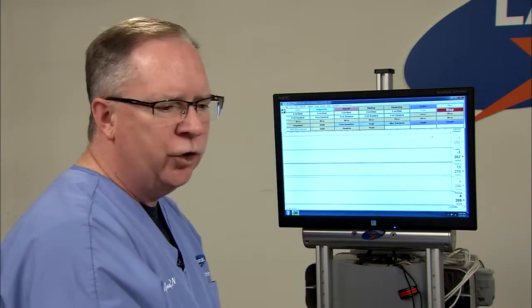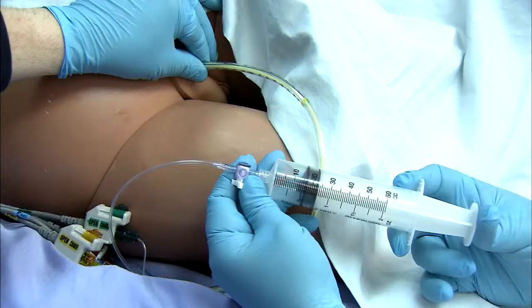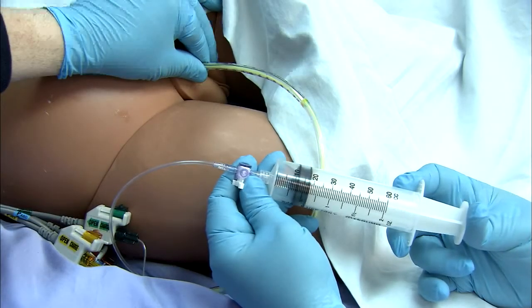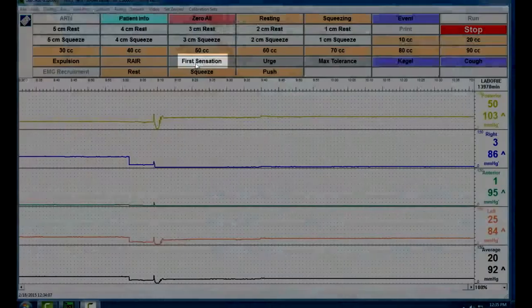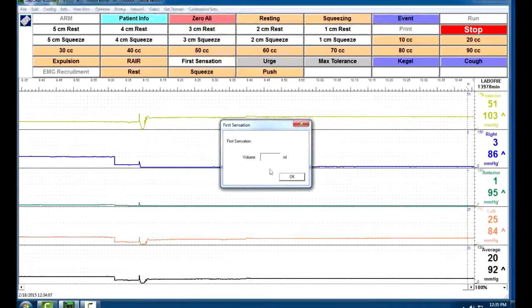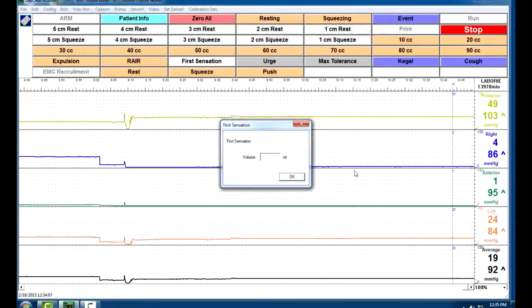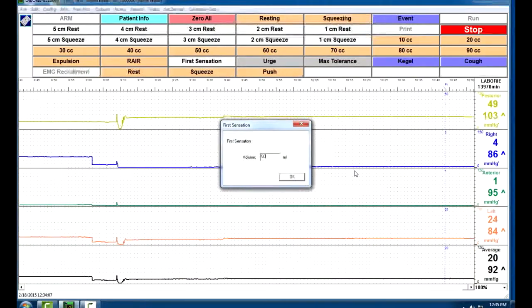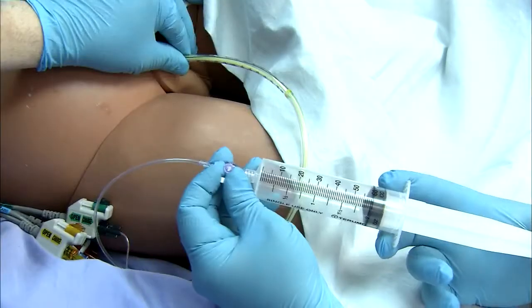Once the patient starts to say, hey, I'm starting to feel something in the rectum, we then look at the syringe and find out how much air has been put in. Let's say it's at 50 cc's. We go ahead and click first sensation on the control panel, and a box will pop up asking you what the volume of the air is at that point, and you simply insert the value and click OK. You then continue to fill the balloon.